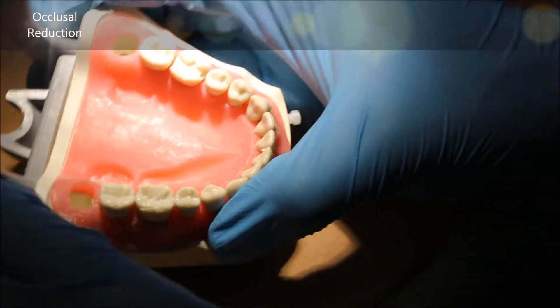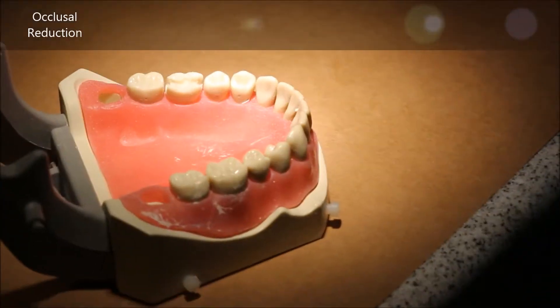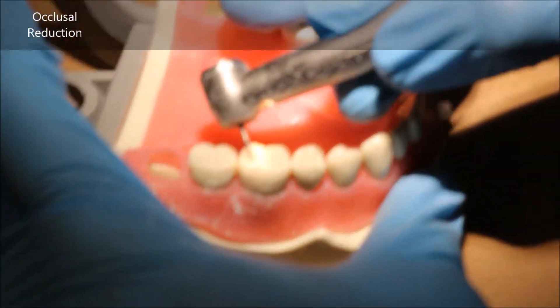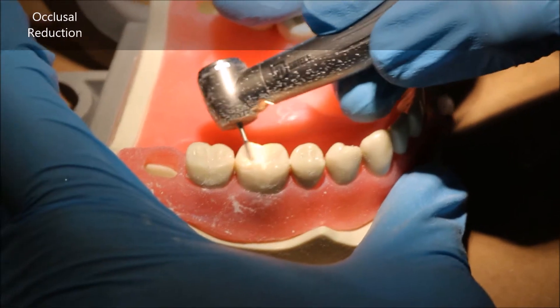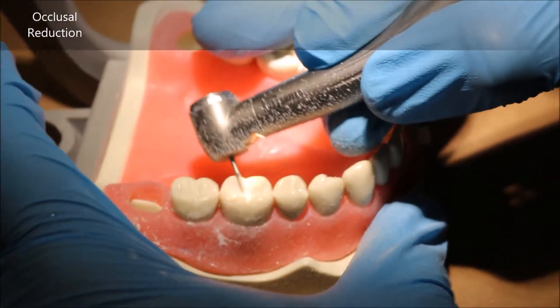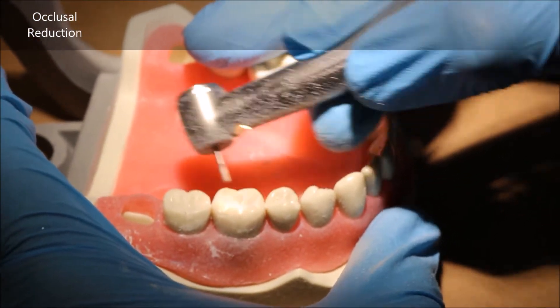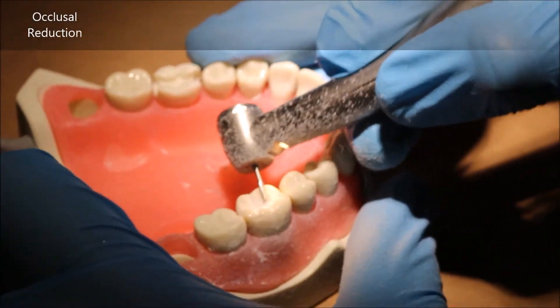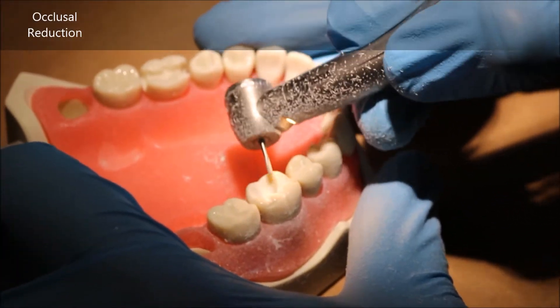Now you join these grooves. You place it back in one of your depth cuts and then you drag it along, recreating — or rather maintaining — the incline while you connect from one depth cut to the next.